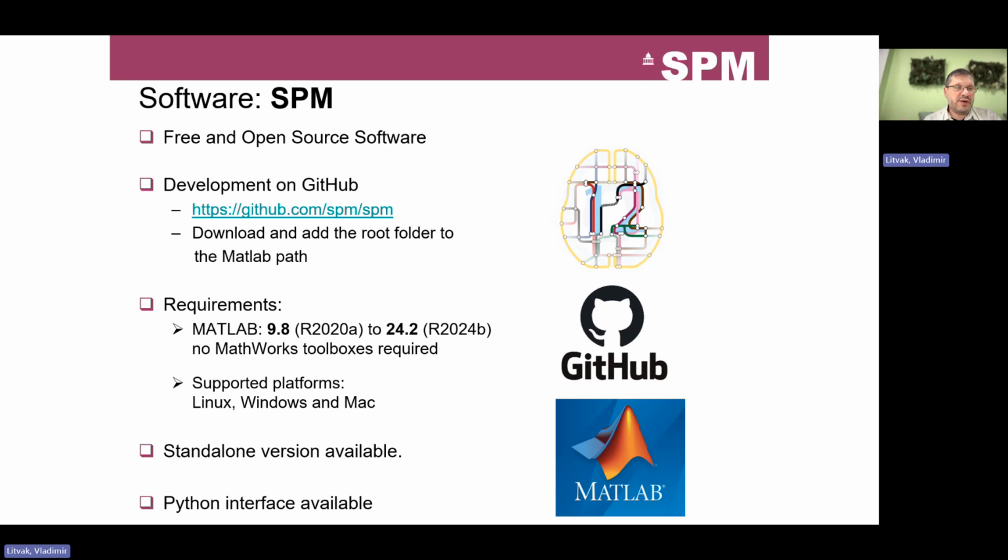So what is actually SPM, and where can you find it? SPM is a free and open source academic MATLAB toolbox. Right now, the main place to go to get the latest version is on GitHub.